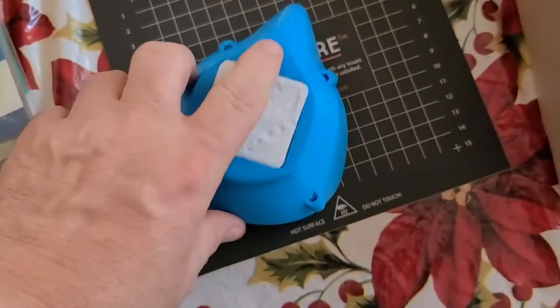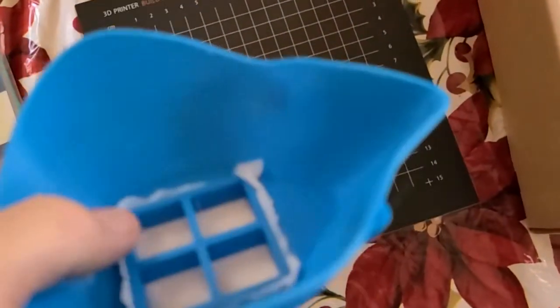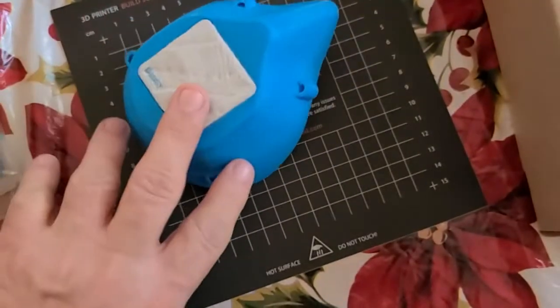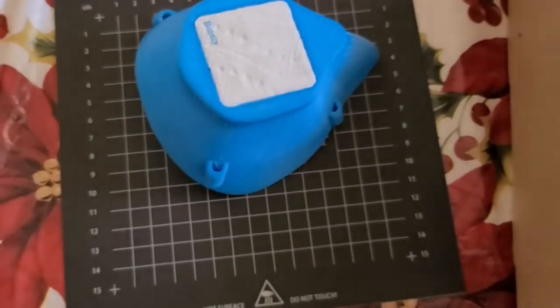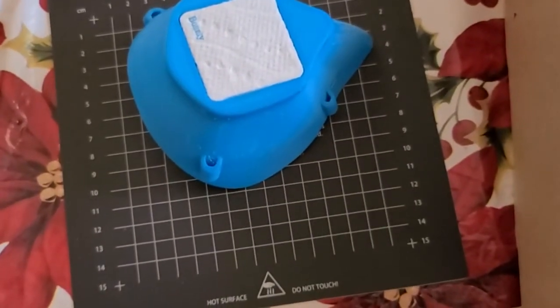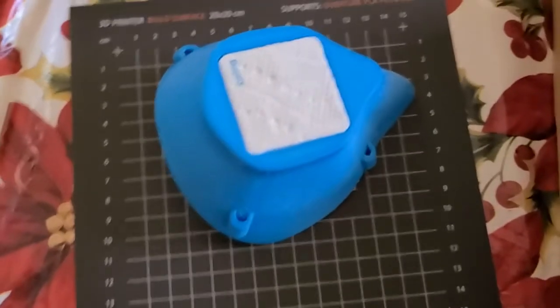I printed this one at about 35% infill. I think you need like 25% with different wall counts. But there are no pinholes through it — you can't see light through it — so it's good.